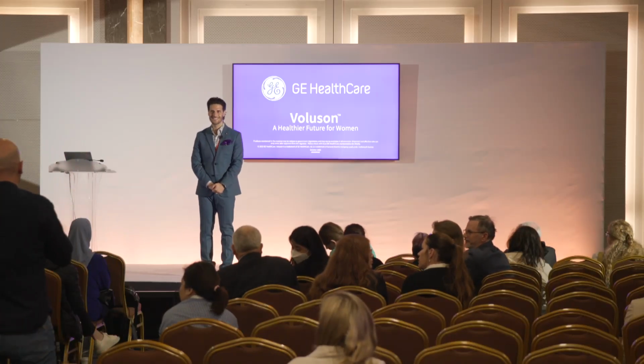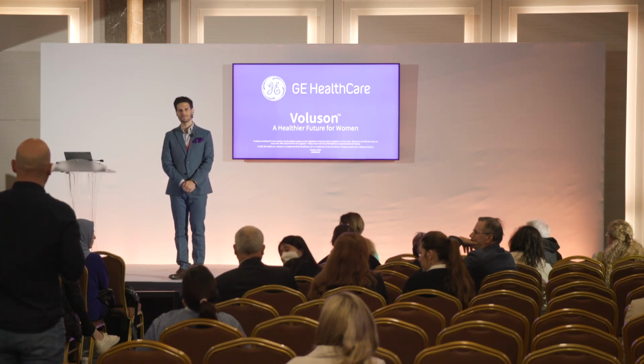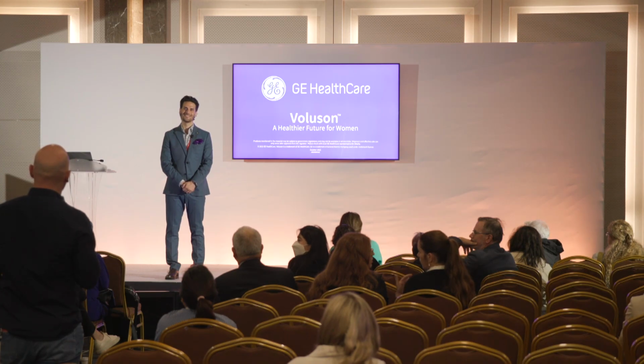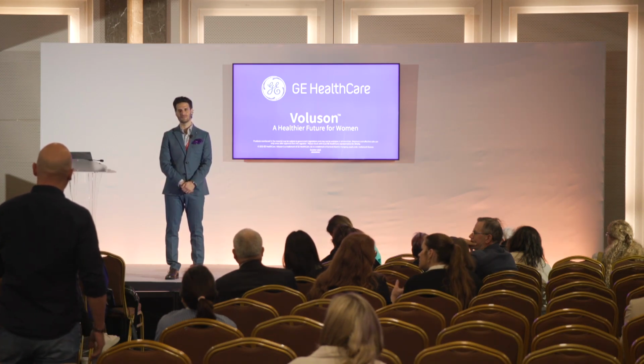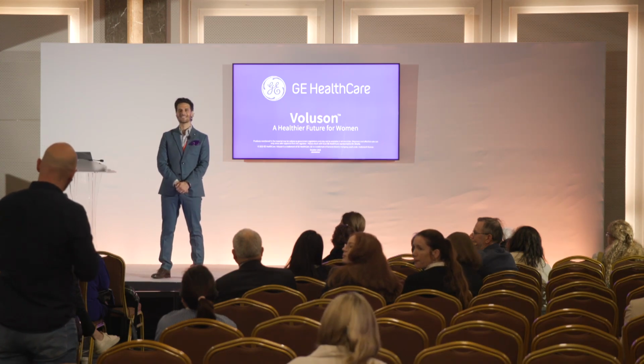Thank you very much. I have two questions. First, I want to thank you, of course, for your work, because now in Finland we use that, since I saw it the first time in Berlin. And this is great, it works. Although my colleagues don't really trust me in this, but it's working.